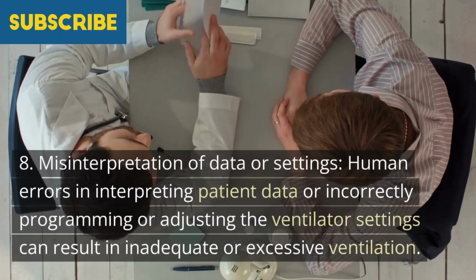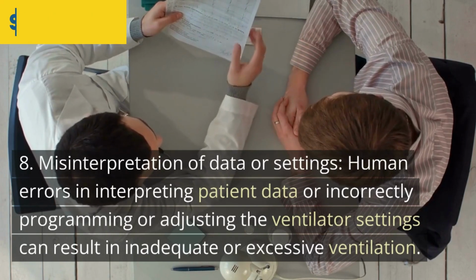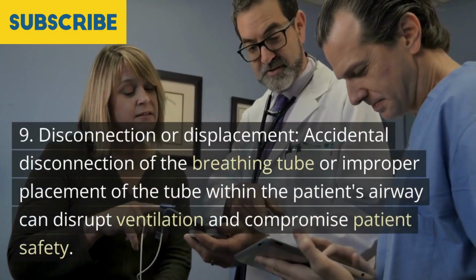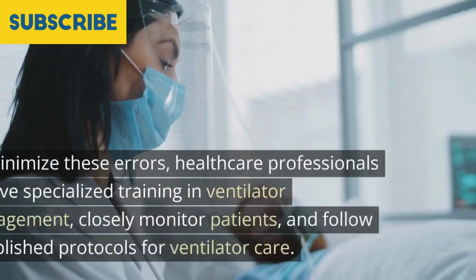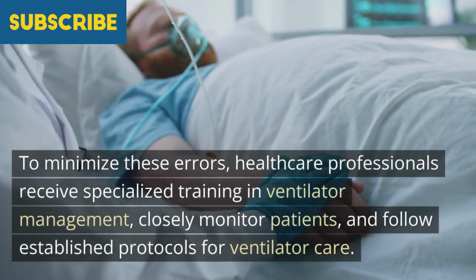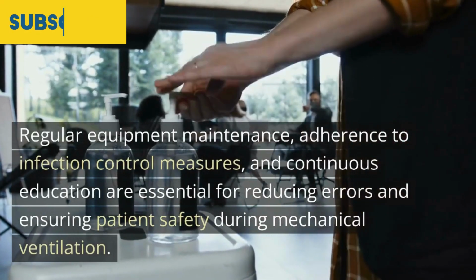8. Misinterpretation of data or settings. Human errors in interpreting patient data or incorrectly programming or adjusting the ventilator settings can result in inadequate or excessive ventilation. 9. Disconnection or displacement. Accidental disconnection of the breathing tube or improper placement of the tube within the patient's airway can disrupt ventilation and compromise patient safety. To minimize these errors, healthcare professionals receive specialized training in ventilator management, closely monitor patients, and follow established protocols for ventilator care. Regular equipment maintenance, adherence to infection control measures, and continuous education are essential for reducing errors and ensuring patient safety during mechanical ventilation.